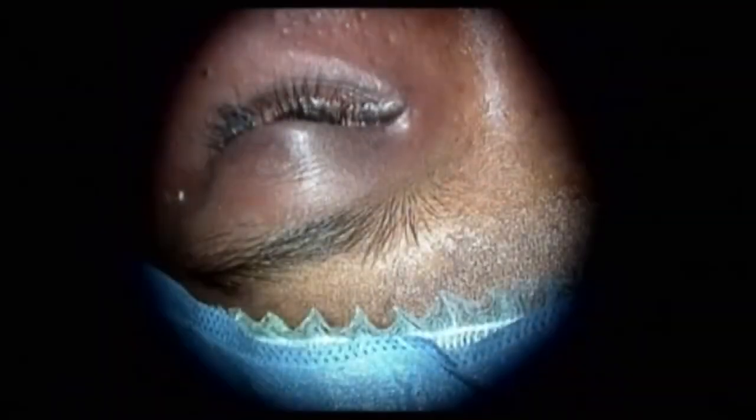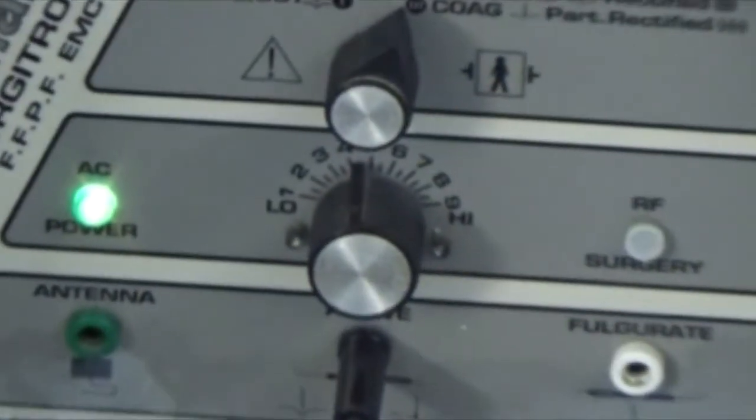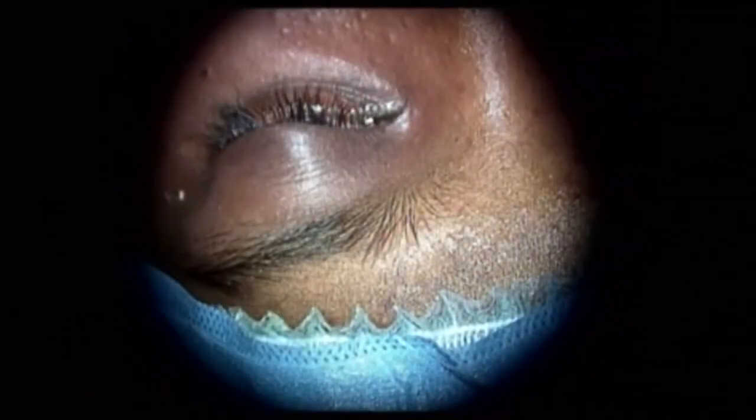Settings on the RF — we are showing the settings on the device. So that's the setting we have. Thank you.